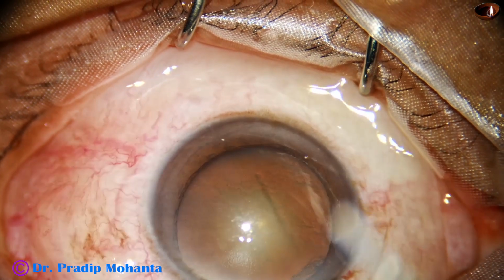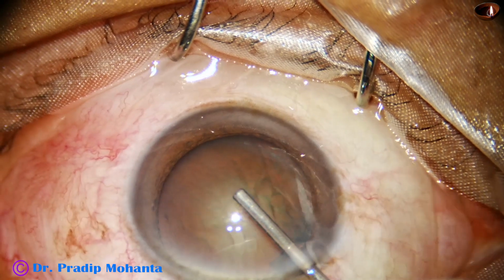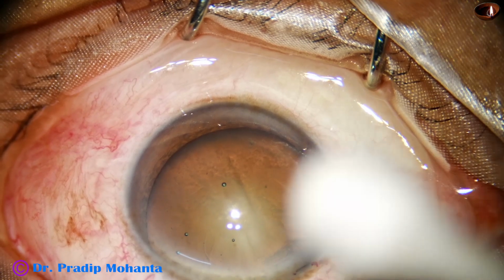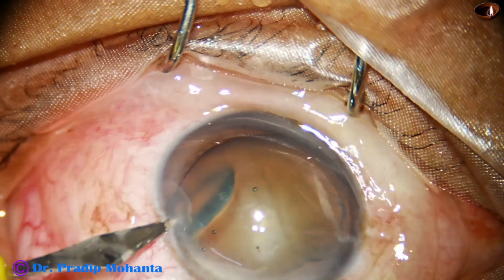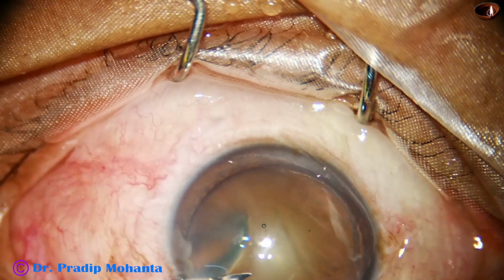Everything is going fine. You can see this is a nice cataract, grade 3 nuclear sclerosis, very good for direct chop, and I have planned direct chop in this case. The side port is made on the left side of the main incision, about 3 clock hours away.